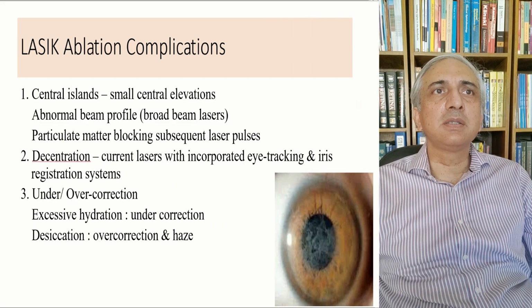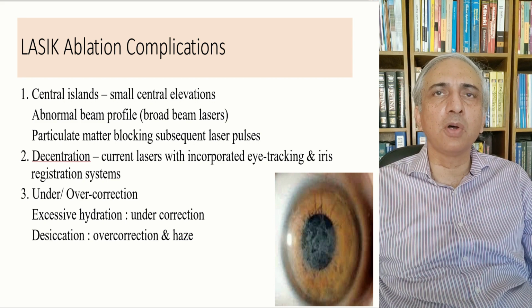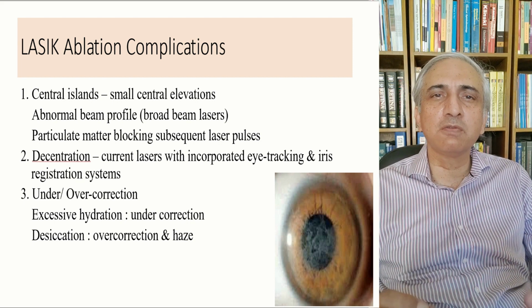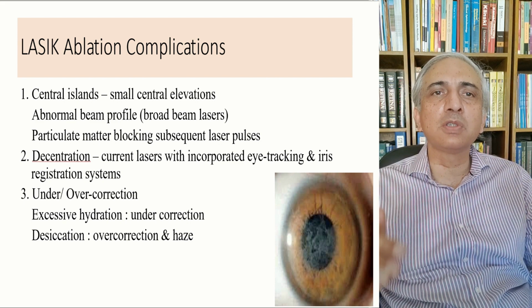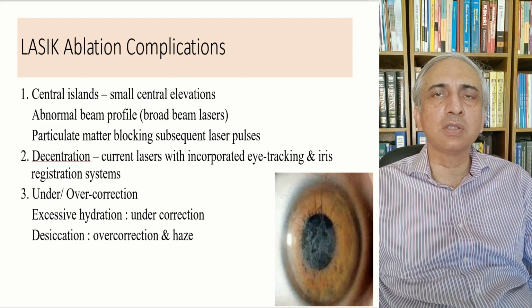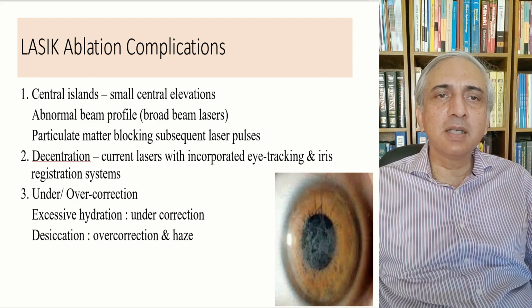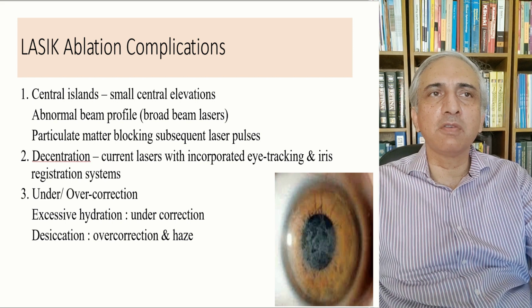The other is central islands, which you see in LASIK: small central elevation, abnormal beam profile, broad beam lasers, particle matter blocking subsequent laser pulses. So it's very important that there should be no fibers, no dust in that room which could settle on the cornea and produce any islands. Decentration: current lasers with incorporated eye tracking and iris registration systems have very minimized decentration, because decentration is a big cause of halos and poor results after refractive surgery.